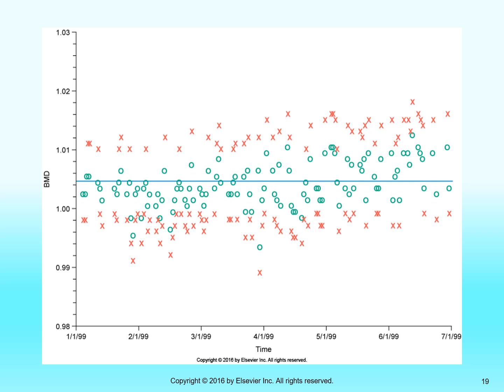The red machine is scoring all over the place with wide variance. Okay, whereas the green machine is more precise. The accuracy is the same because the average is the same for both data sets, but the precision is better in the green machine on this slide. Okay, that's the difference between precision and accuracy. It's how tightly together the measurements are.